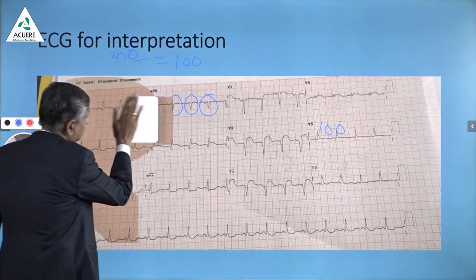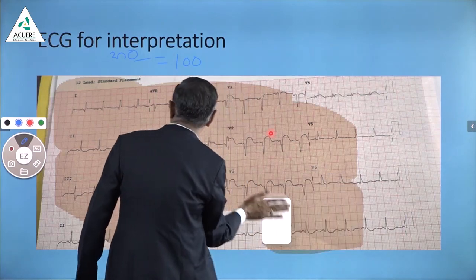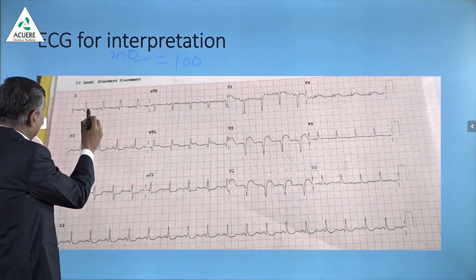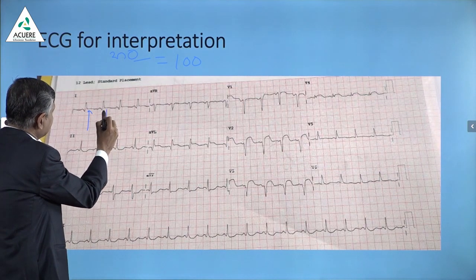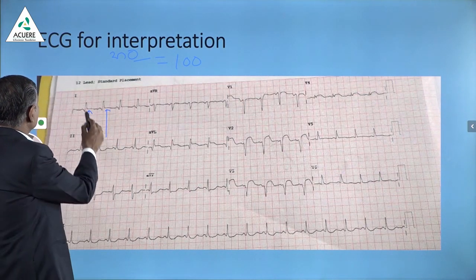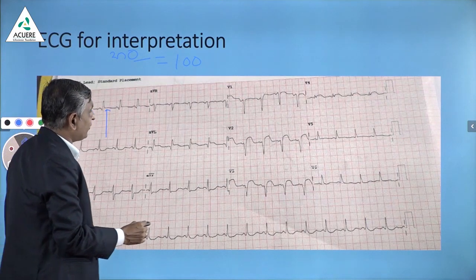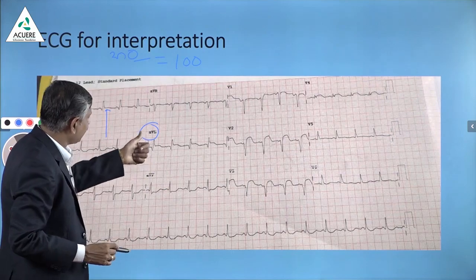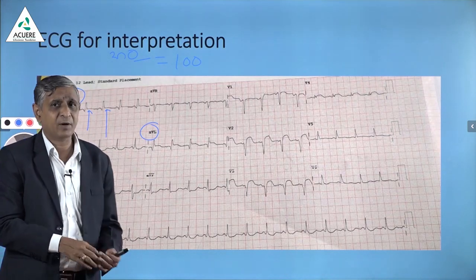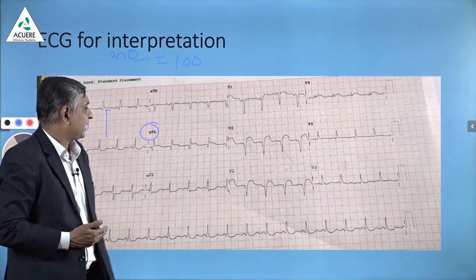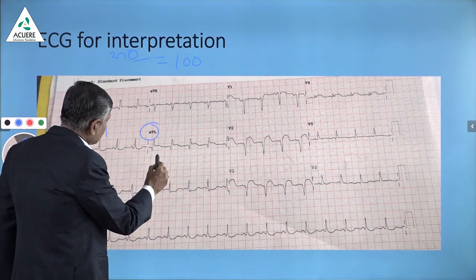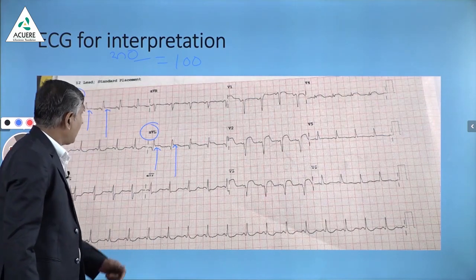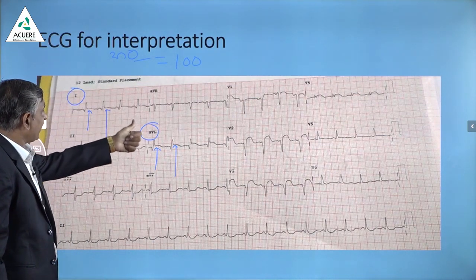In this particular ECG, starting from lead one, you will find that there is a little ST elevation. Whenever you see lead one, you should always check AVL as well, because both of these represent the lateral side — the upper lateral side of the heart. In this AVL also, you are getting ST elevation. So ST is elevated in both lead one and AVL.